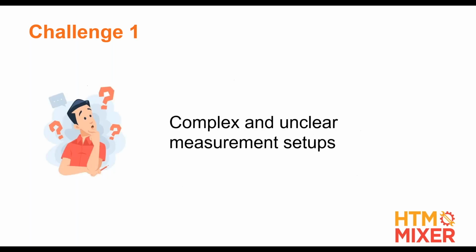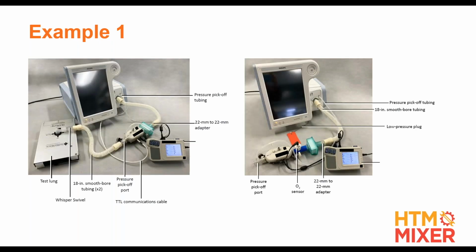Okay. All right, let's talk first about these complex and unclear measurement setups, and we'll show you some examples that we see. Here's one from a manufacturer, and they actually went kind of a long ways down the road of showing you how to set up an analyzer on their ventilator. They did a pretty good job. They have a lot of pictures. The problem is not all the things are very clear there.